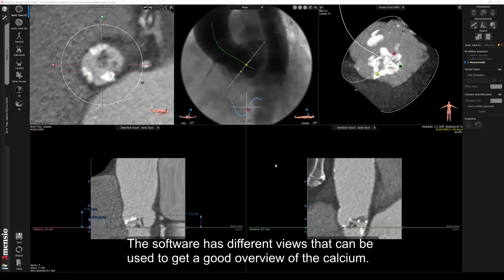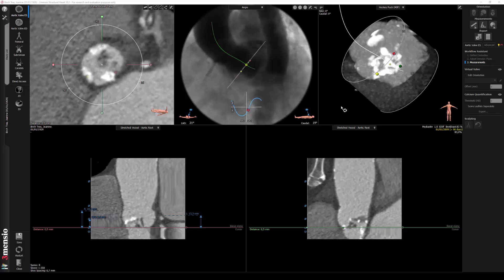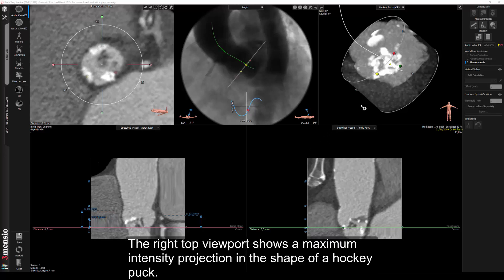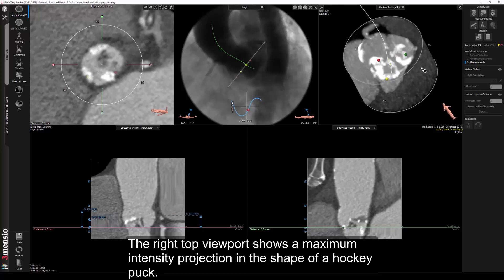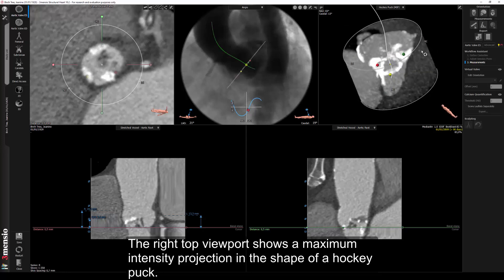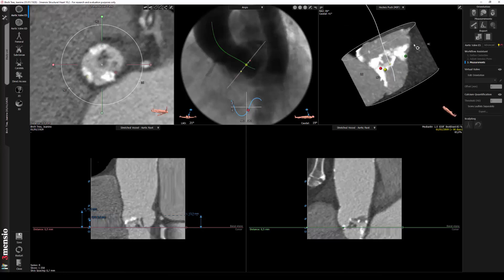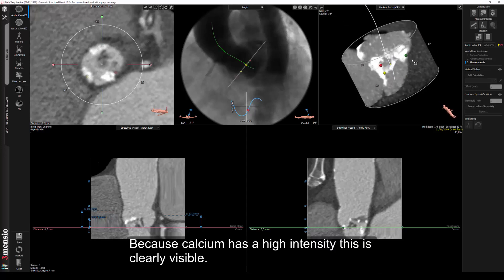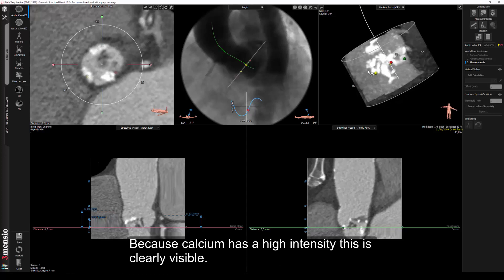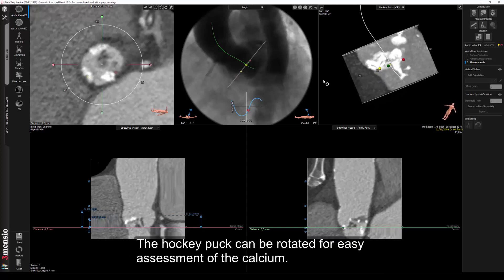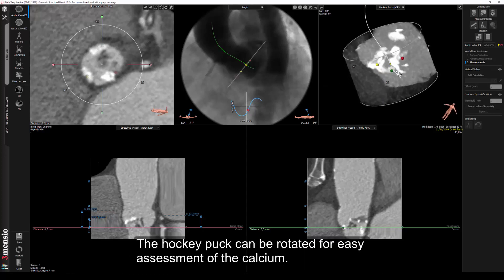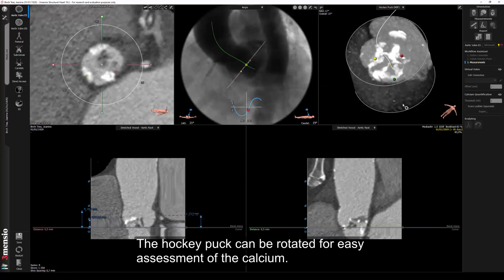The software has different views that can be used to get a good overview of the calcium. The right top viewport shows a maximum intensity projection in the shape of a hockey puck. Because calcium has a high intensity, this is clearly visible. The hockey puck can be rotated for easy assessment of the calcium.